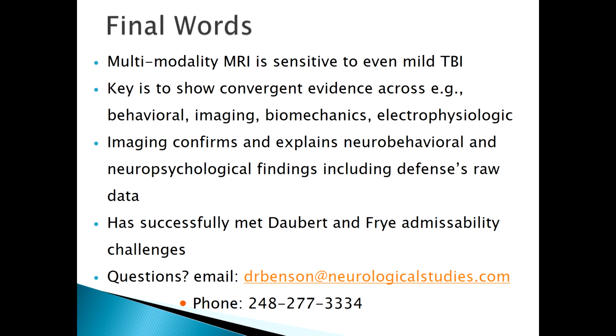We think certainly that in persistent symptomatic cases, the DTI positive rate is high, and we're currently trying to give objective numbers to that. But our impression is that it's probably 90%, possibly higher than that.